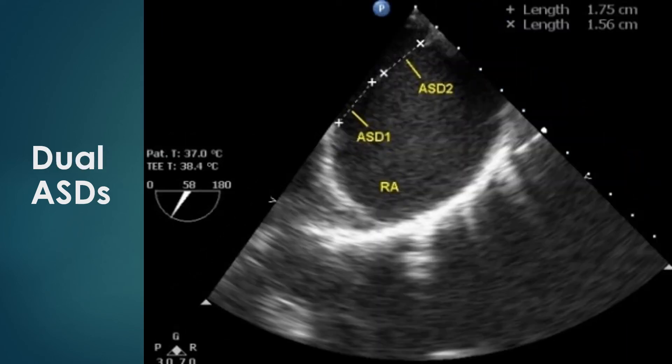This transesophageal echo image shows dual atrial septal defects with a small intervening segment of atrial septum. One defect measures 17.5 mm and the other measures 15.6 mm, totaling 33.1 mm. The rims at both ends appear deficient, so device closure may not be feasible. Surgical closure will be ideal, provided there are no features of irreversible pulmonary hypertension.